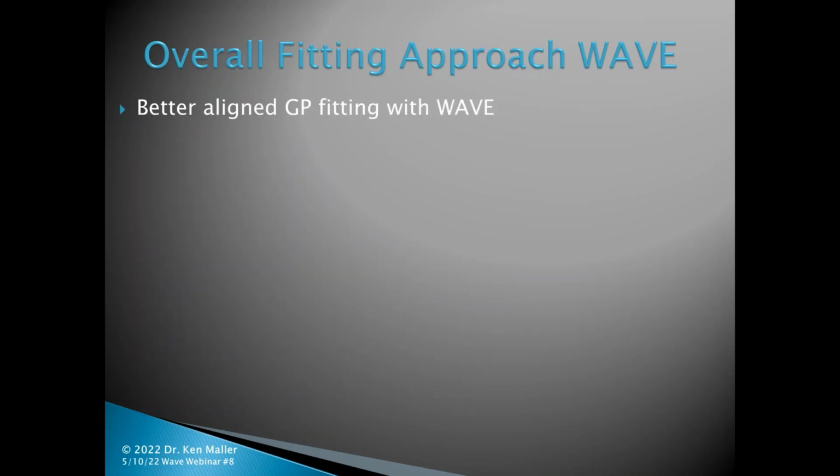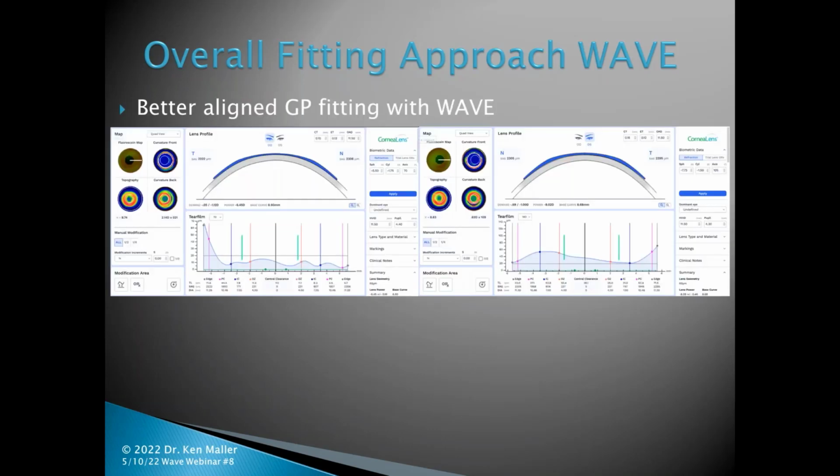So she decided to come and make the trip, and here's the pair of lenses that I had designed for her and her RK eyes. Freeform, 11.5 millimeters on the right. She's about a -550. Yes, she's minus. She had been a very, very high myope prior to her RK surgery, and she never really quite got down to plano. But instead of the typical hyperopic sequelae that you would expect from an RK eye, she actually receded back and is now fairly myopic, although not as myopic as she was prior to her RK surgery, which I think was about a -11.